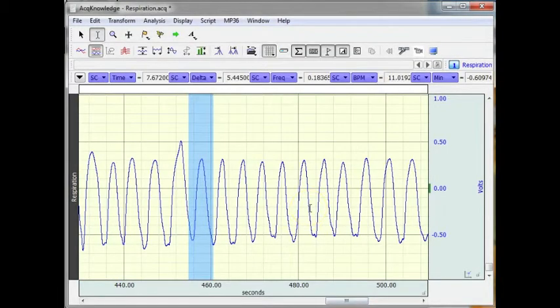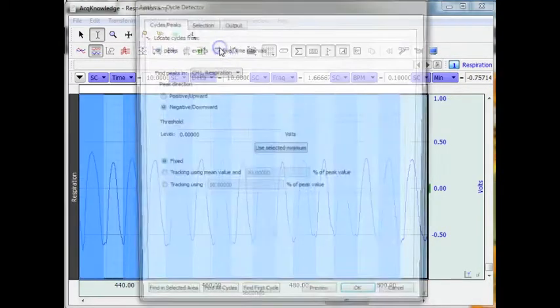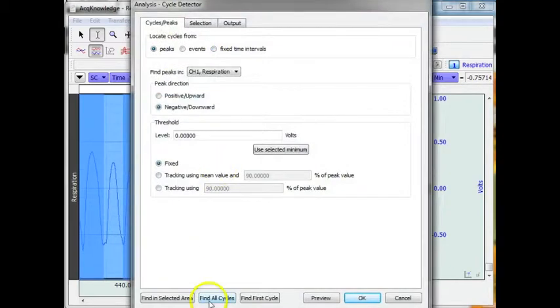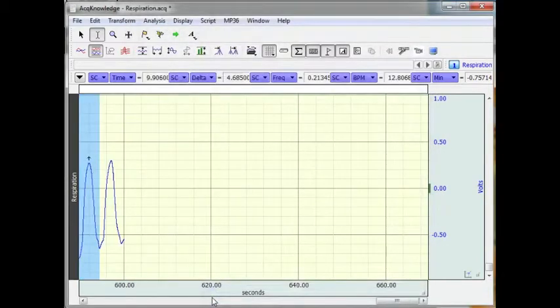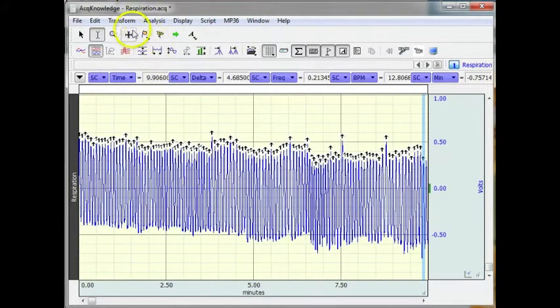And select OK. Select all my data and then find all the cycles. Now we have got a nice arrow, an upward arrow on each of my waveforms.